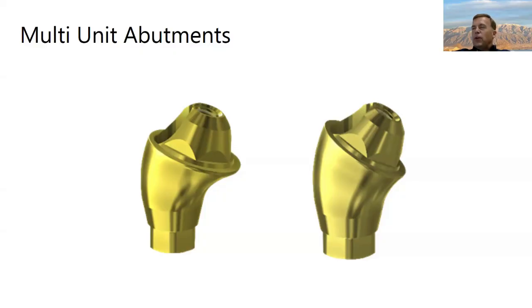And then the third thing is when you're doing digital workflows, always go to MUAs. So you're going to need to use a universal MUA if you want to do a digital workflow. Two things I wanted to mention about this.